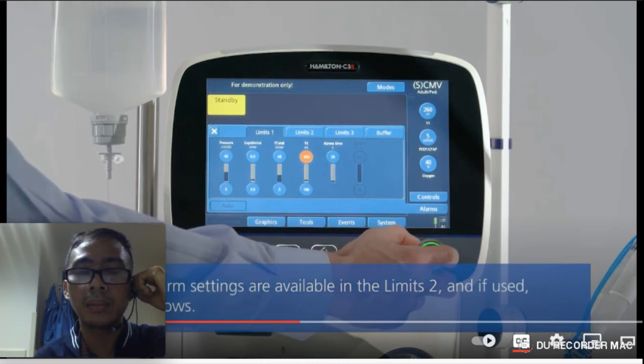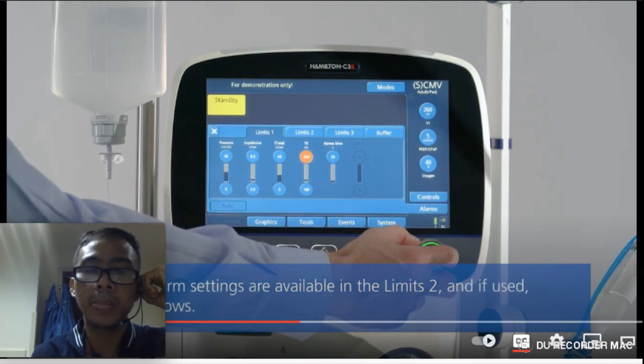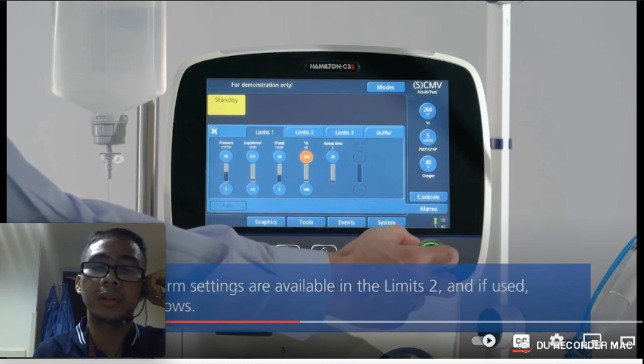So kayo, back up na kayo ng fundamentals ng knowledge as we discussed before sa PowerPoint that the ventilator can also cause barotrauma. So how can we prevent barotrauma? By setting your alarm limits, particularly your peak airway pressure. So that's your PIP, you know.